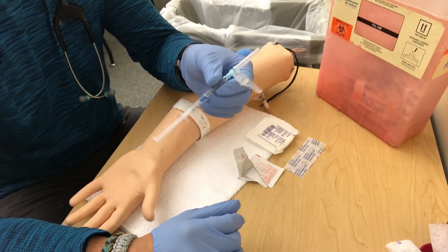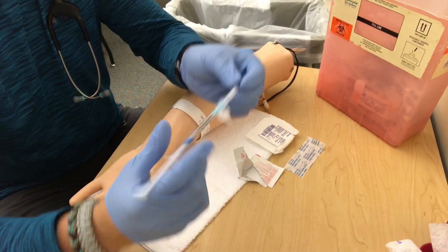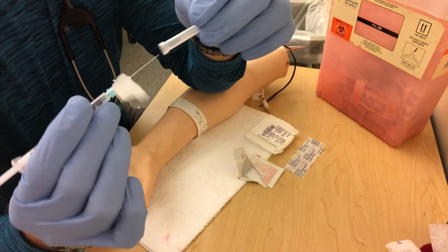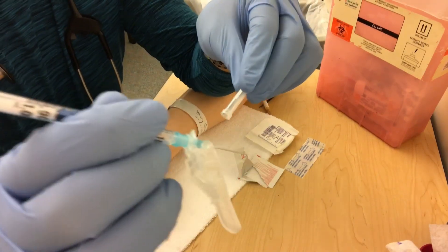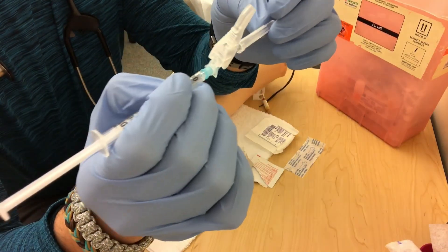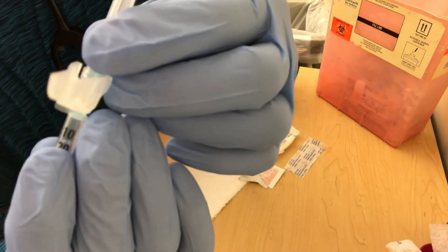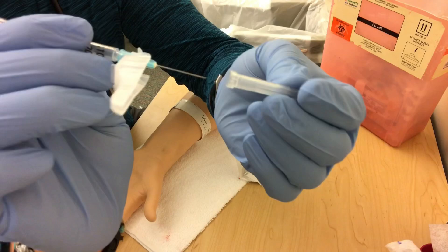The first thing I do when getting the needle ready for the ABG is there's this little guide on here. If you don't position this properly, it'll get in the way. So when I put the needle on, we want to go bevel up. I make sure I can twist and adjust where the bevel is, and I put the gauze off to the side so it doesn't get in my way.